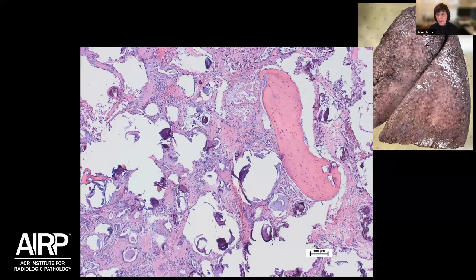Now, looking under the microscope at the histology specimen, we can see on this medium power view that there is some high density material there. These deep purple brownish lesions or collections. What is that? Looking at the lung parenchyma itself, we can see that the alveolar walls have deposition of collagen, which to me is always suggestive of some sort of chronic inflammatory process with some post-inflammatory changes, maybe the residual features of lung organization.